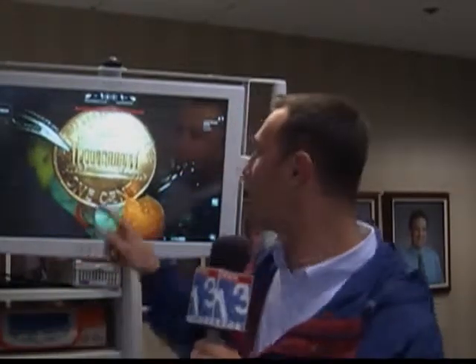Now, this technology is a lot more detailed than your conventional surgery. It uses 3D HD 1080p technology, and it's so detailed you can see something in this penny you probably have never seen before. There's Abraham Lincoln right there.